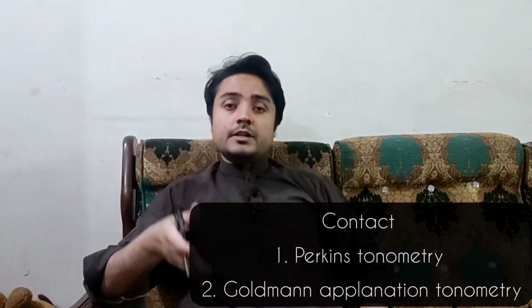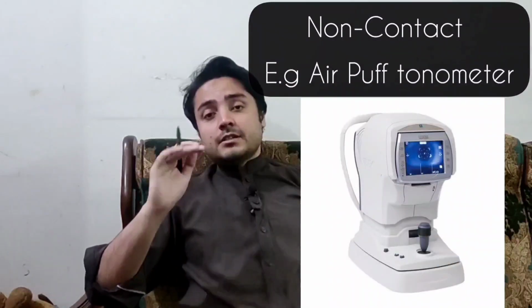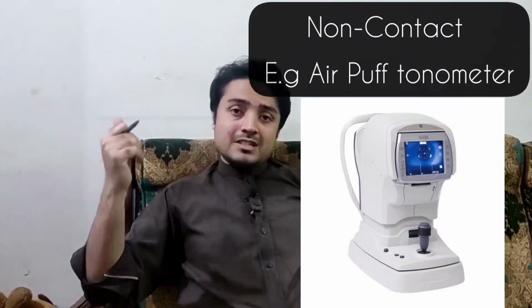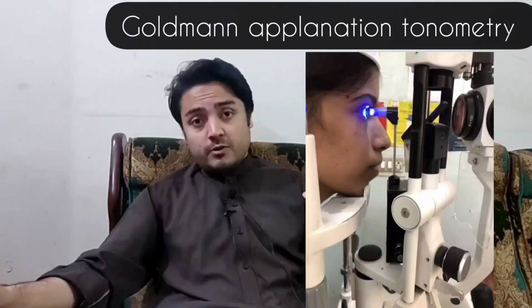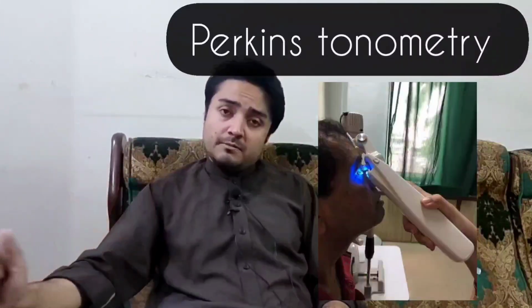In contact tonometry, the Goldmann applanation tonometry and Perkins tonometry come. In non-contact, as the name suggests, there is no contact between the device and the patient's cornea, and here there is the air puff tonometer. In this video, we'll be talking only about Goldmann applanation tonometry, and we can make another video on the other one. Goldmann applanation tonometry is the gold standard used worldwide. It is the ideal of all the IOP measurement methods. And there's also the Perkins tonometer method.